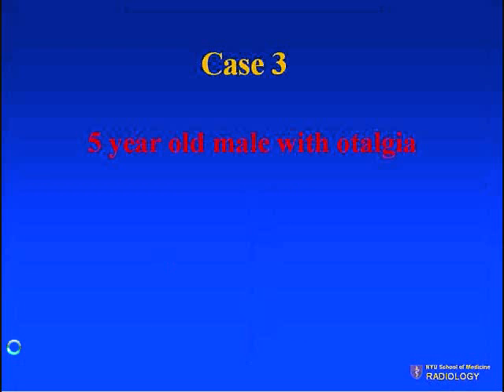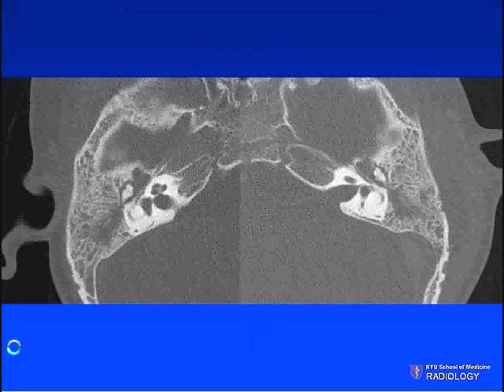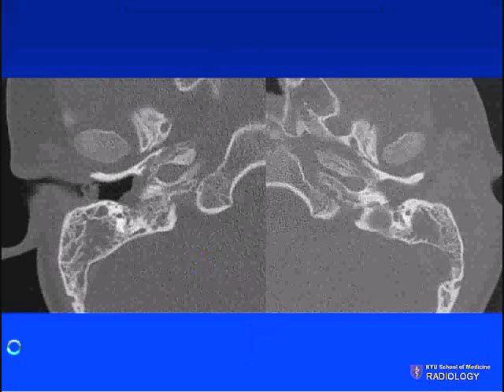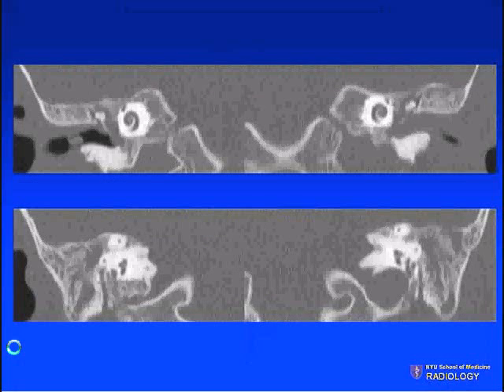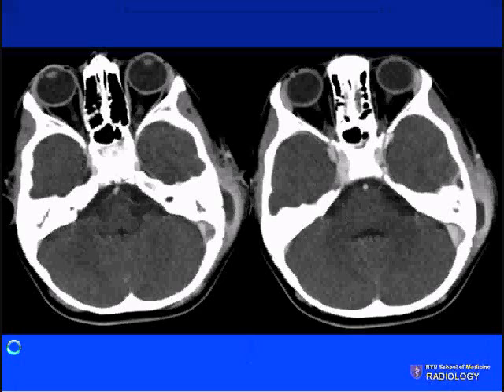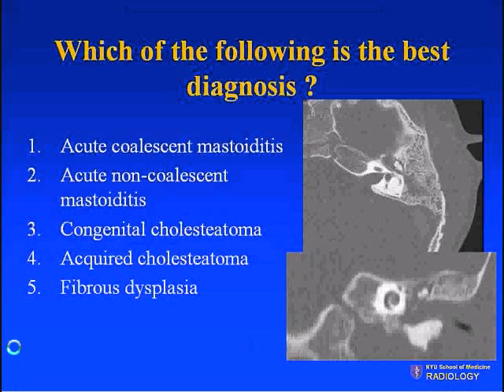Case number three: a five-year-old male who presented with otalgia. Here are axial images, further axial images, coronal images, and soft tissue windows through the temporal bone. Which of the following is the best diagnosis? Number one, acute coalescent mastoiditis; number two, acute non-coalescent mastoiditis; number three, congenital cholesteatoma; number four, acquired cholesteatoma; number five, fibrous dysplasia. Here is the key axial image and the coronal image.